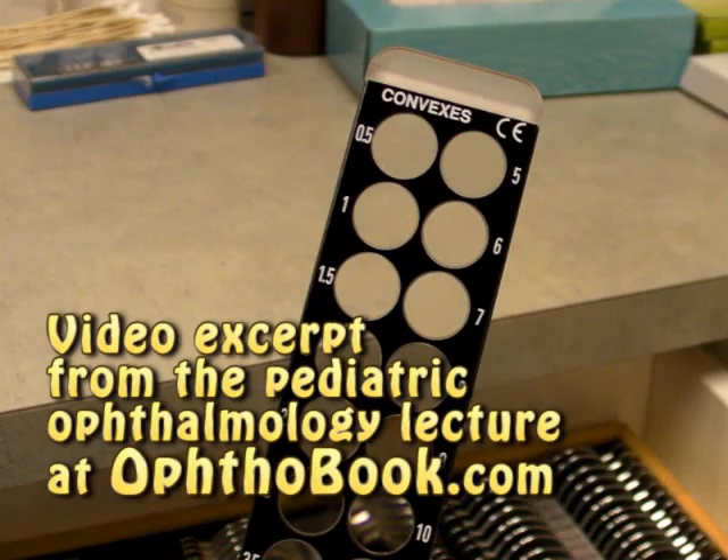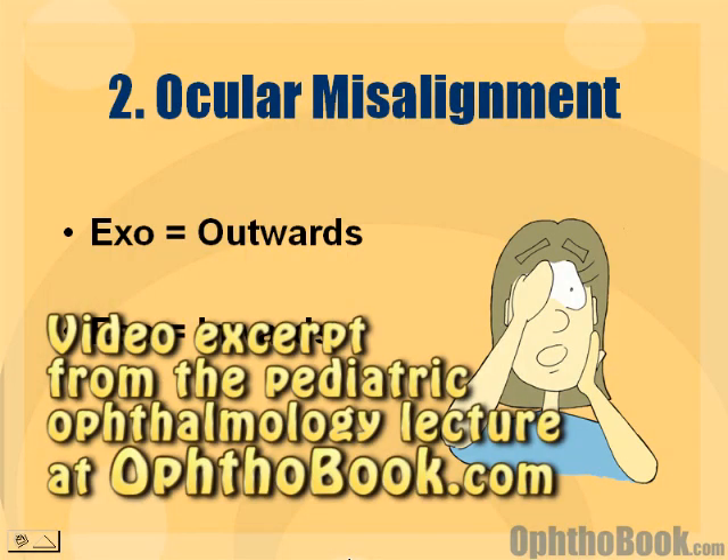Retinoscopy — an incredibly difficult skill to pick up, but very useful in both pediatrics and with adults.